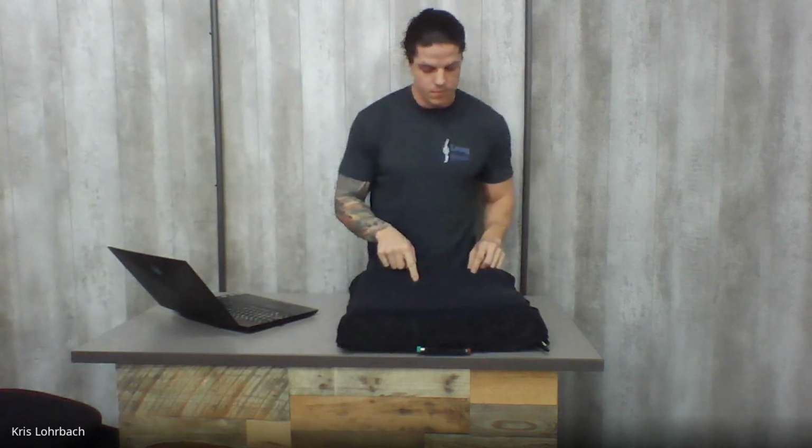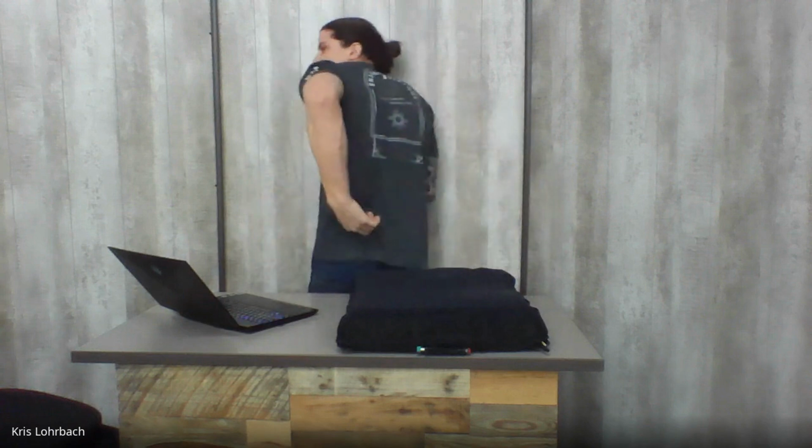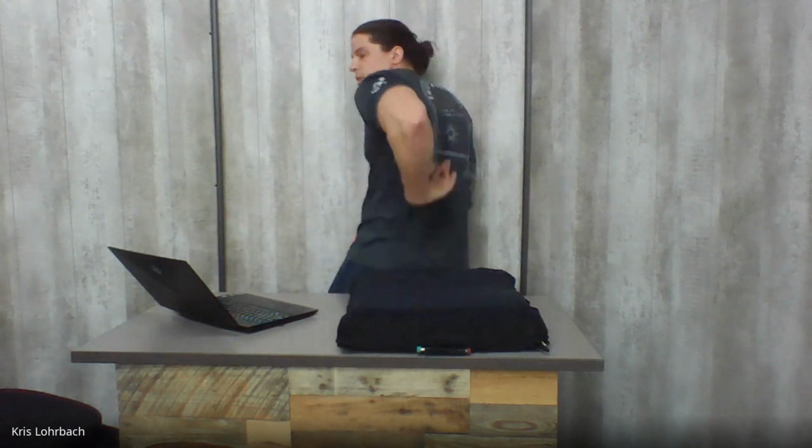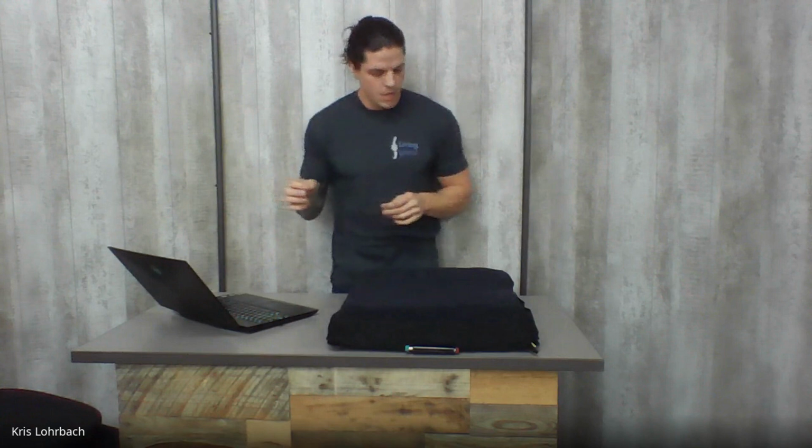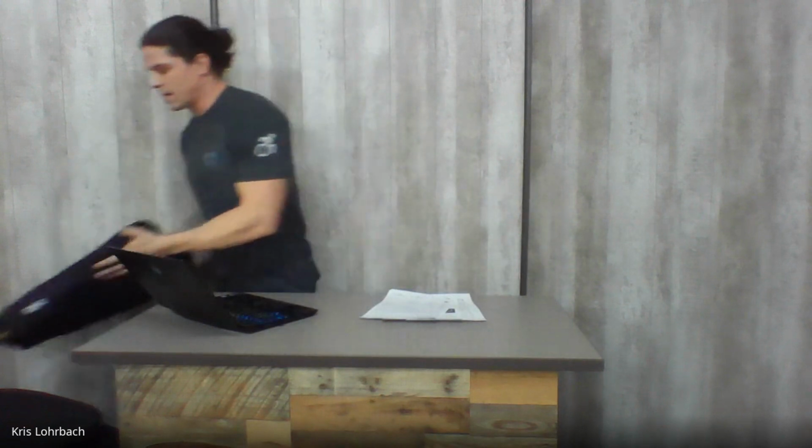cushion that might have a relief section for the coccyx. So your coccyx is right here at the bottom of your tailbone. It's the lowermost point of your spine. And a lot of cushions have little cutouts for it because people tend to sit on it. They call it sacral sitting. A modified off-the-shelf cushion might have a cutout for that. And when it's about to be shipped, they'll put in a special air section or a special gel section, and we'll ship that out the door. You get that a lot. And you'll see that in our option sets on our website. People can select an option for the cushion and have it shipped out.